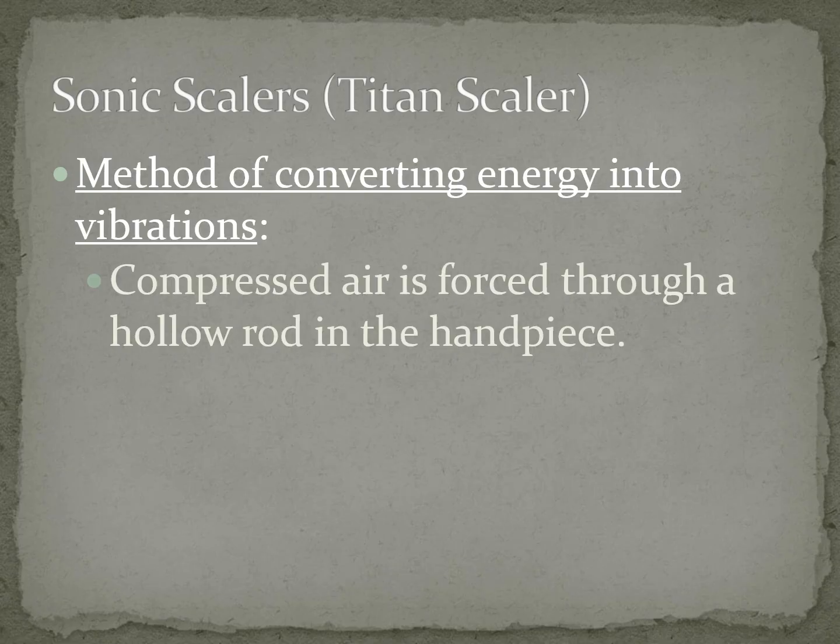Now our sonic scalers. These are usually only available in standard diameter tips, which again is going to limit our access. So our ultrasonics, we saw that there are tons of different tips. So your tips for your sonic scalers are going to be much more limited, and they are going to be simply threaded onto a handpiece.